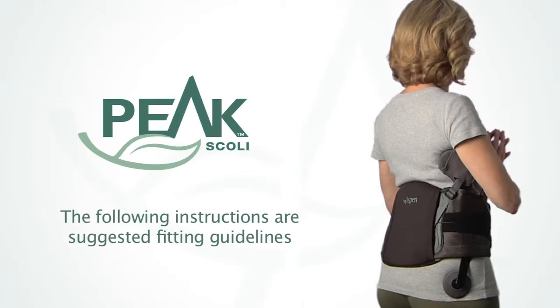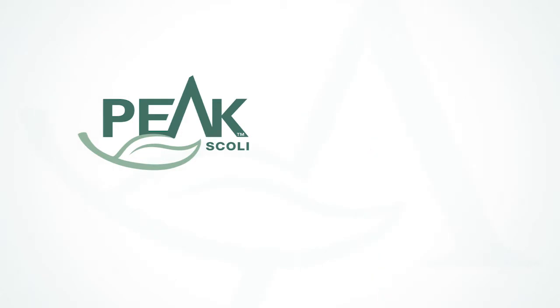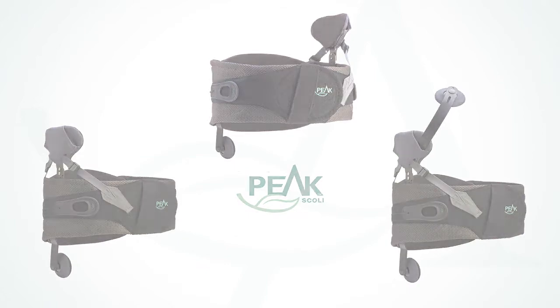The Peak Scoliosis Bracing System is an unloader brace designed to provide pain relief for adult scoliosis patients. The brace is designed to be customized based on each patient's unique conditions and anatomies.